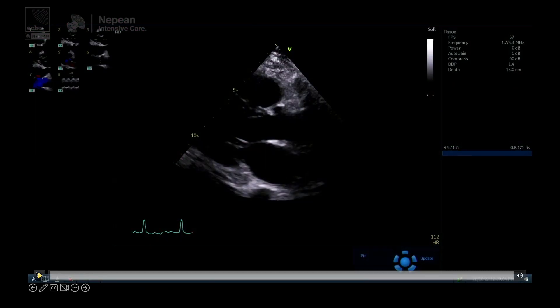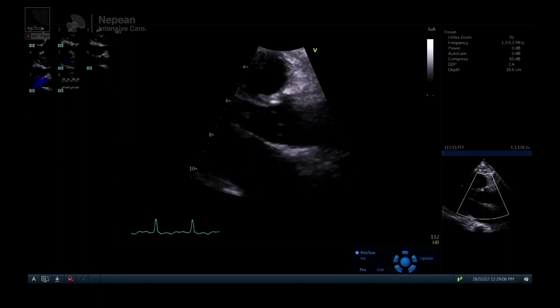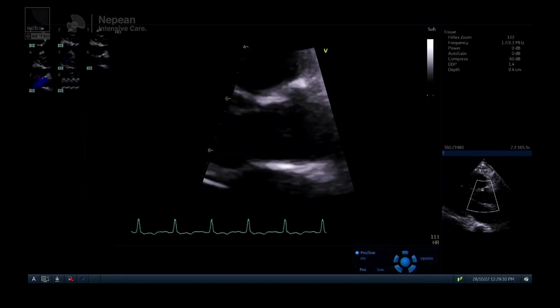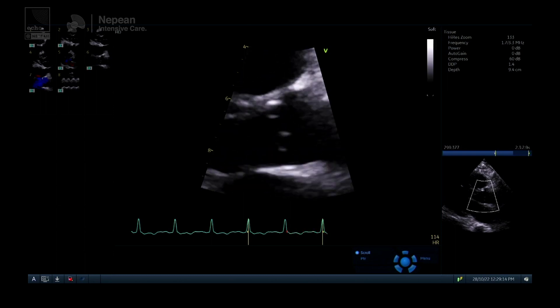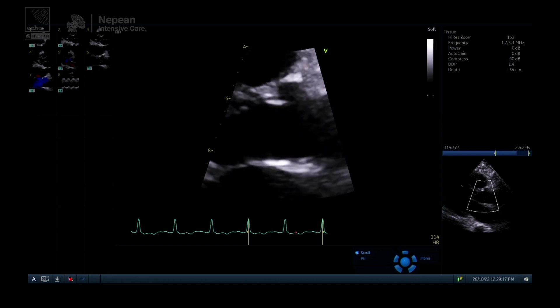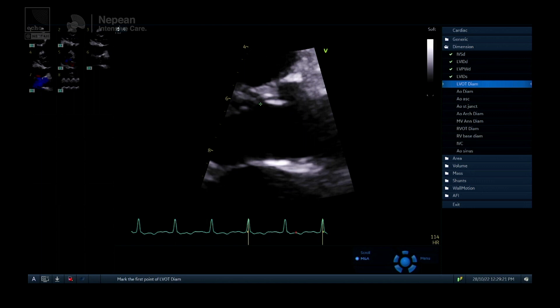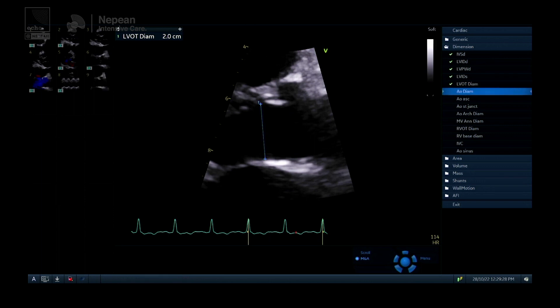We zoom in on a parasternal long axis view, pause in mid-systole, and measure at the insertion tips of the aortic valve leaflets at the base where they join the septum and the anterior mitral leaflet. Zooming in gives us as much precision with our measurement as possible. We scroll forward and back to find mid-systole when the leaflets are open, then measure at the base of those leaflets. A normal range is approximately 1.8 to 2.2 cm — values outside that should prompt re-measurement.